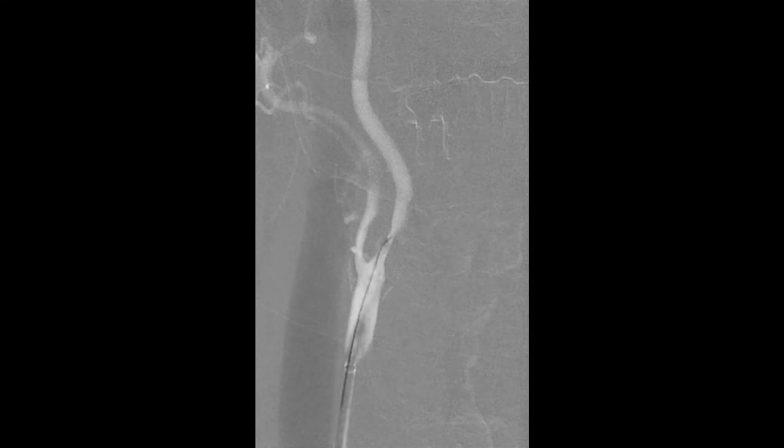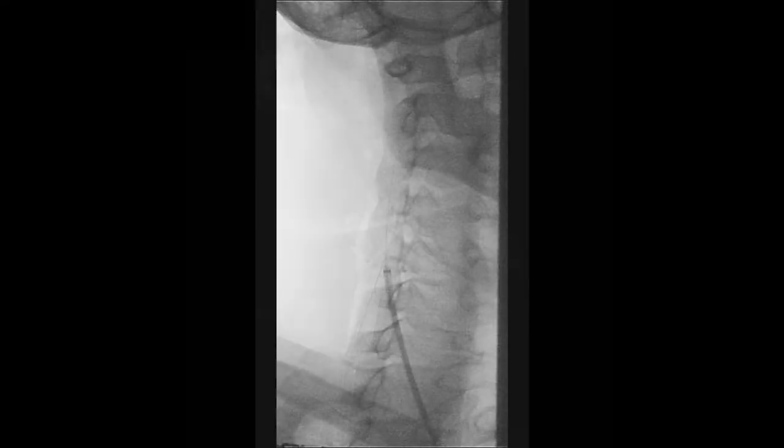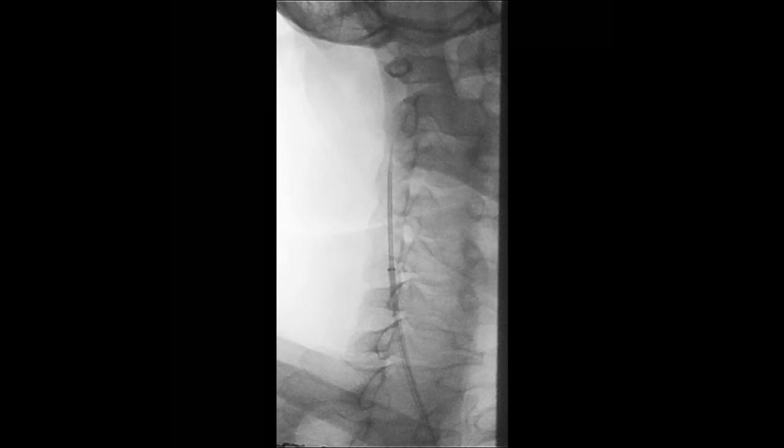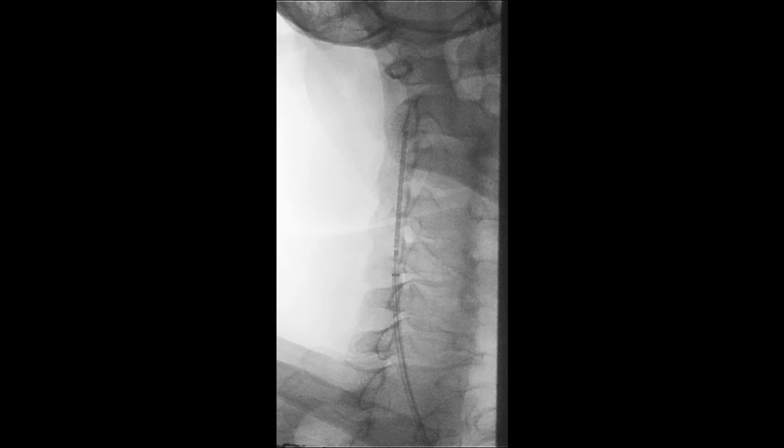Introduce and advance the stent through the lesion. Once the stent is positioned in the stenosis, conduct the following steps to deploy the SeaGuard Embolic Prevention Stent System.